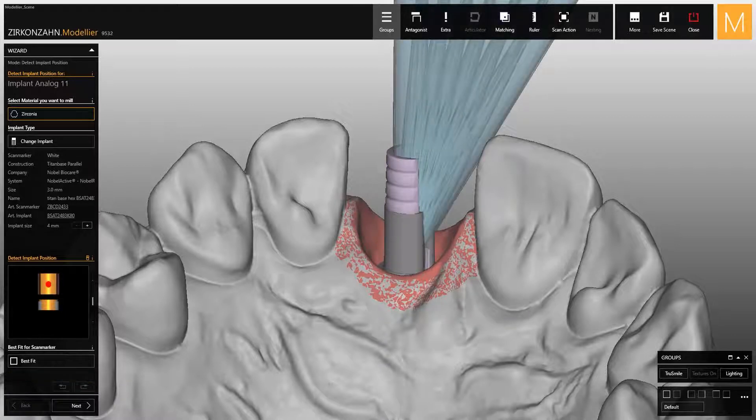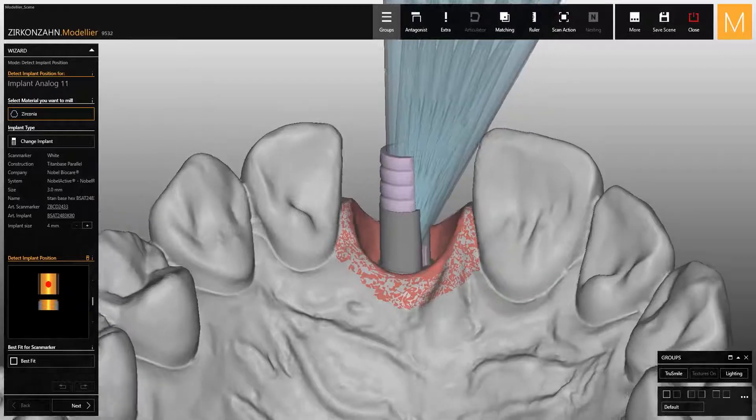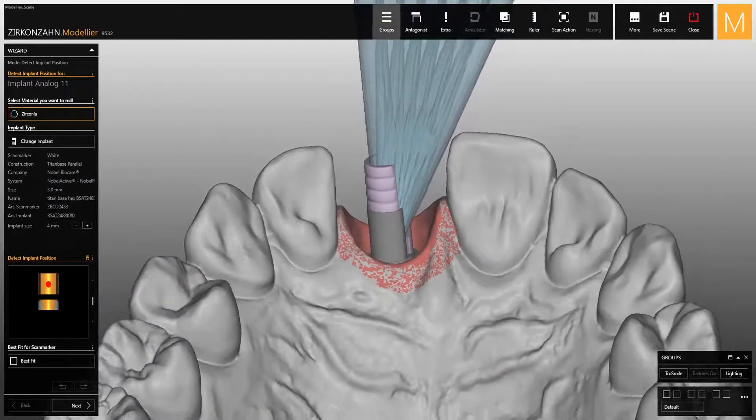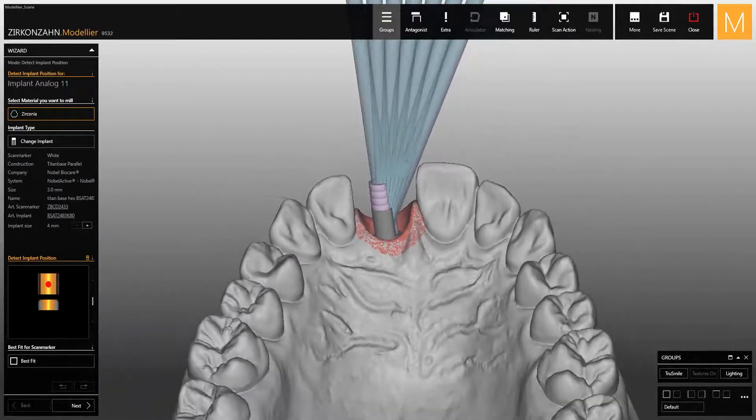In addition, you can also view all possible angles of the screw channels, which vary from 0 to 30 degrees.